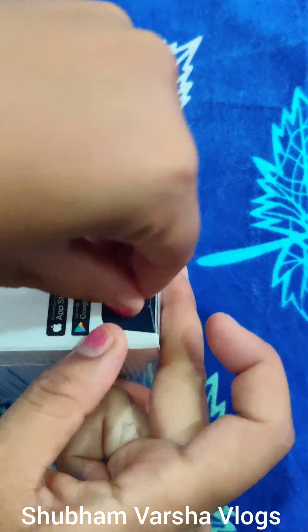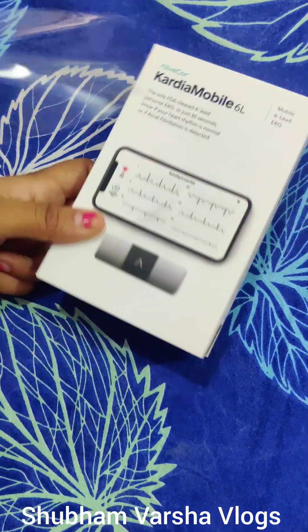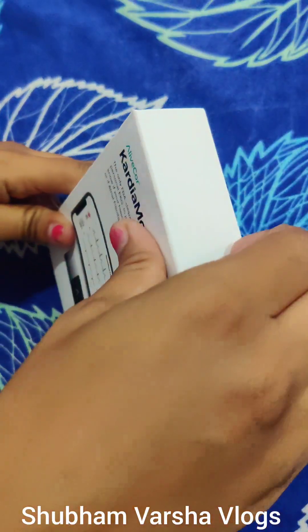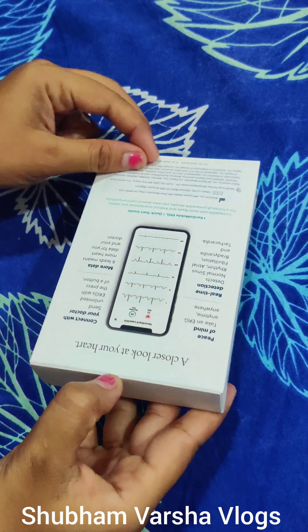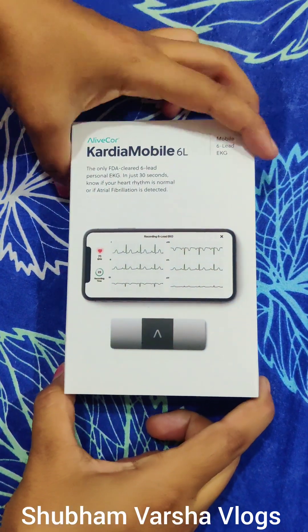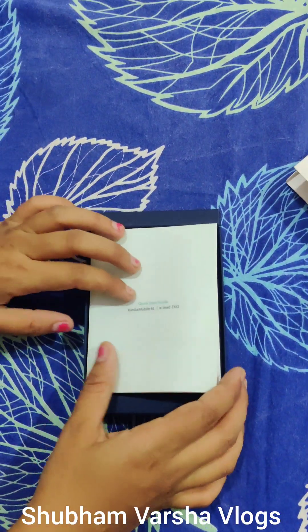So first of all we will remove this gelatin sheet or packing. The Cardio Mobile App is available for both Android and Apple Store. Also, this device is US FDA approved, which ensures the authenticity of the device.